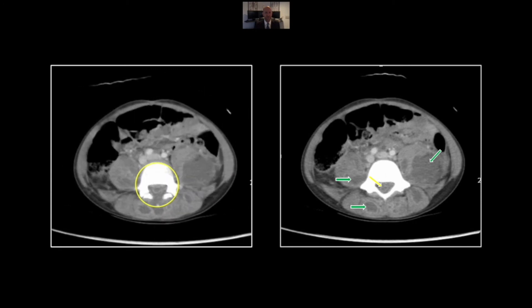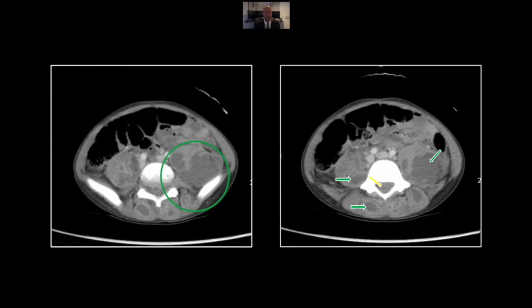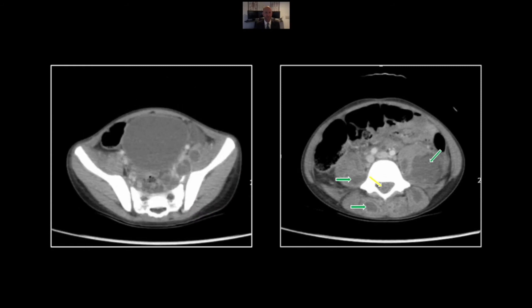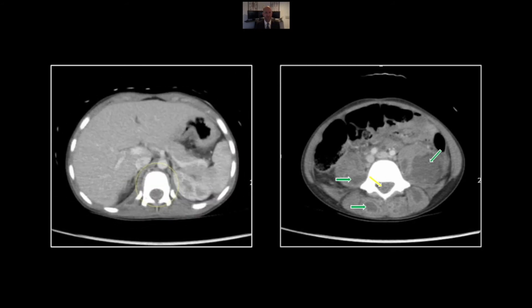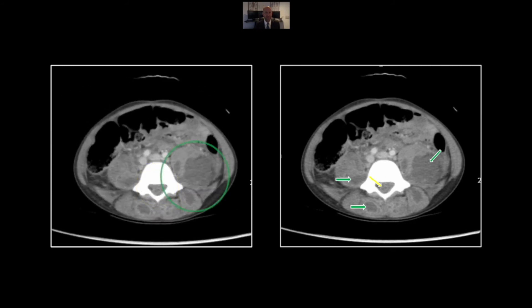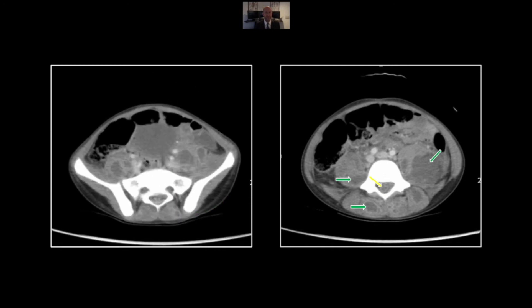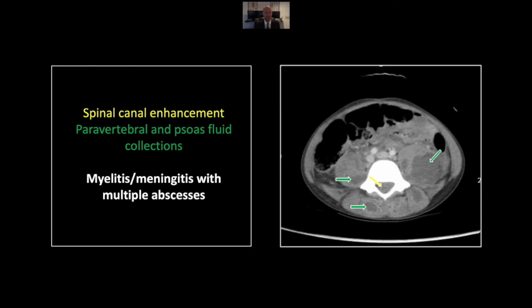All the way down to the thecal sac, there is enhancement, and in the paravertebral tissues as well, extending down into the pelvis. You can see that enhancement throughout the meninges, all throughout the distal thoracic spine there. That is an infectious myelitis meningitis with extension into the paravertebral soft tissues.